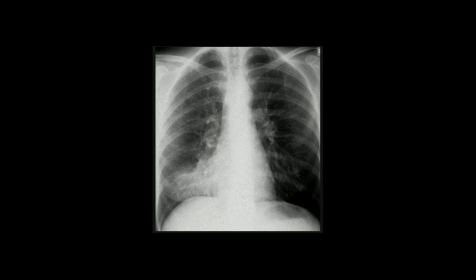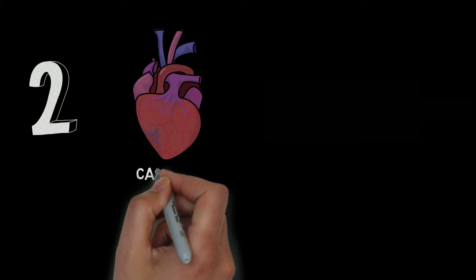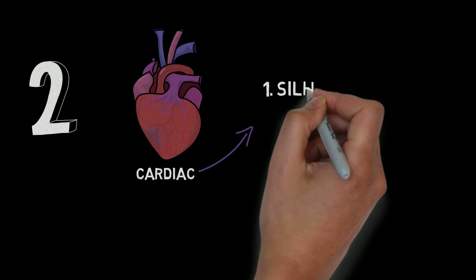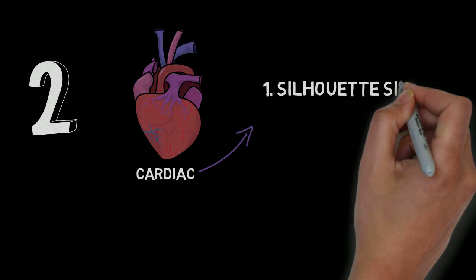Pause now and see if you can identify the abnormalities in this next picture. Hopefully you saw the increased density in what is probably the right middle lobe, but without a lateral x-ray to confirm, it could be the lower lobe. This person has pneumonia.